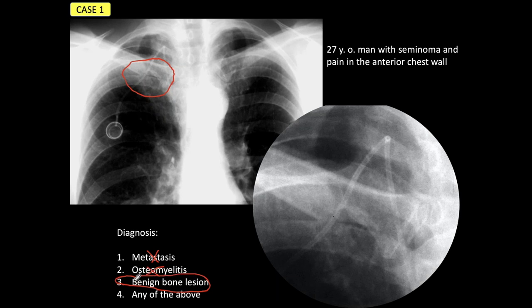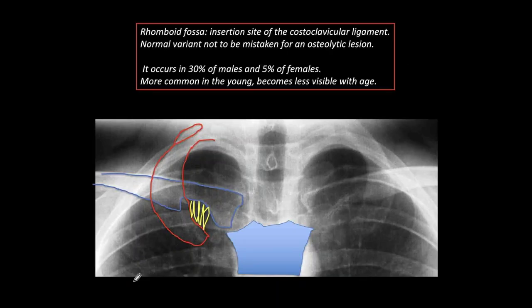The correct diagnosis should be a benign bone lesion without discussion. But this is not a normal benign bone lesion — this is a normal variant called a rhomboid fossa. The rhomboid fossa corresponds to the insertion site of the costoclavicular ligament, seen here between the first rib and the clavicle.